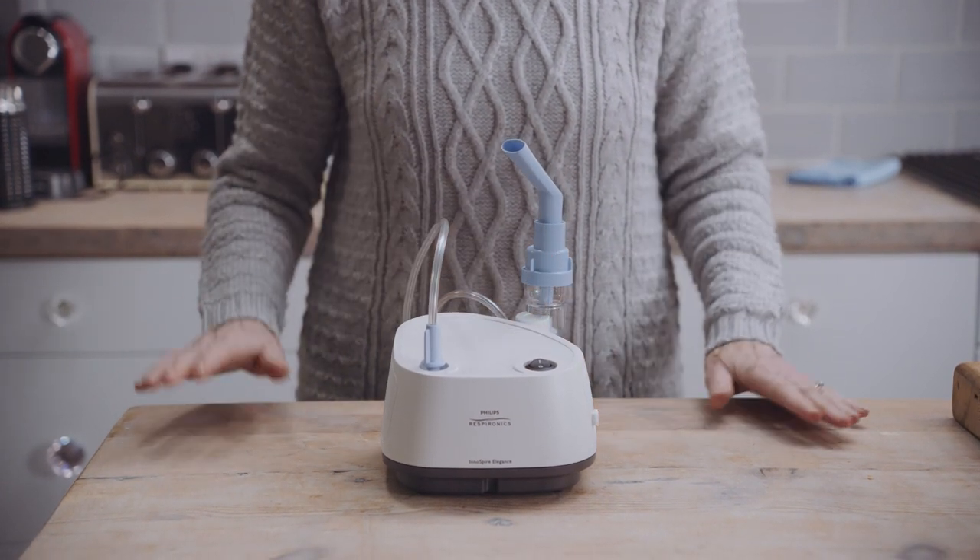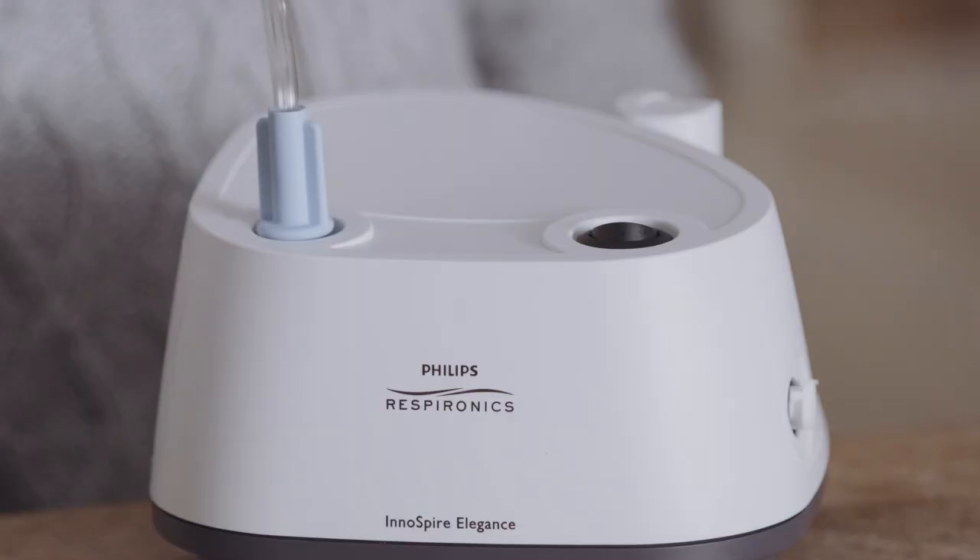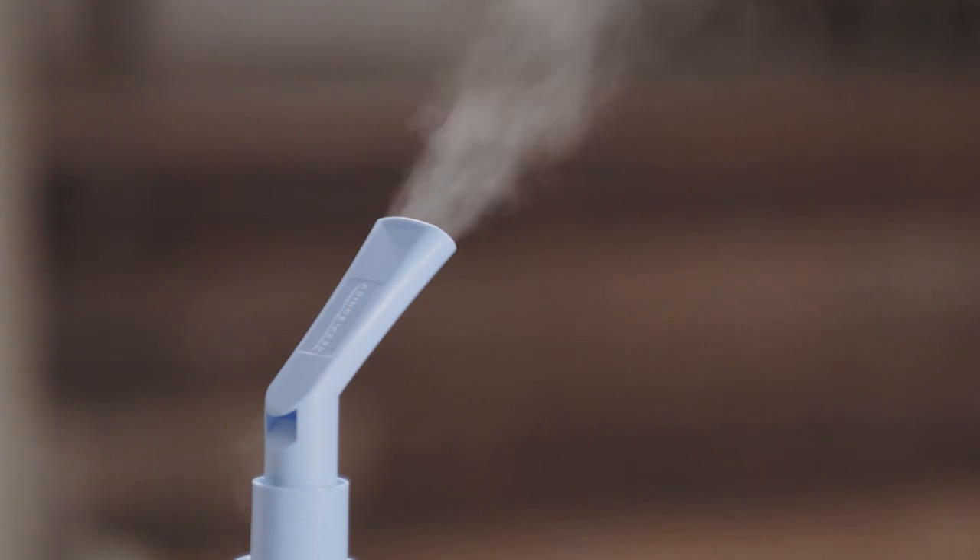You can use the parking post on your device for securing the Sidestream when not in use. To take the treatment, sit in an upright position, relax and switch on the unit. Make sure mist is visibly coming from the mouthpiece or mask.